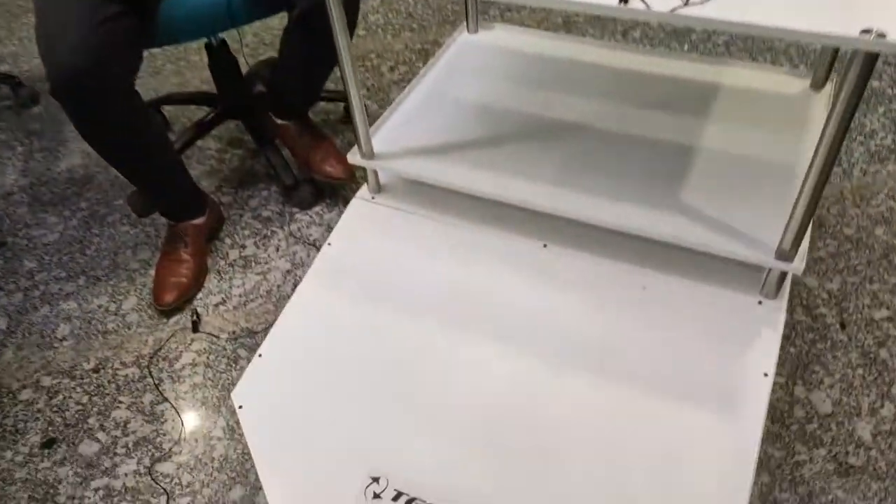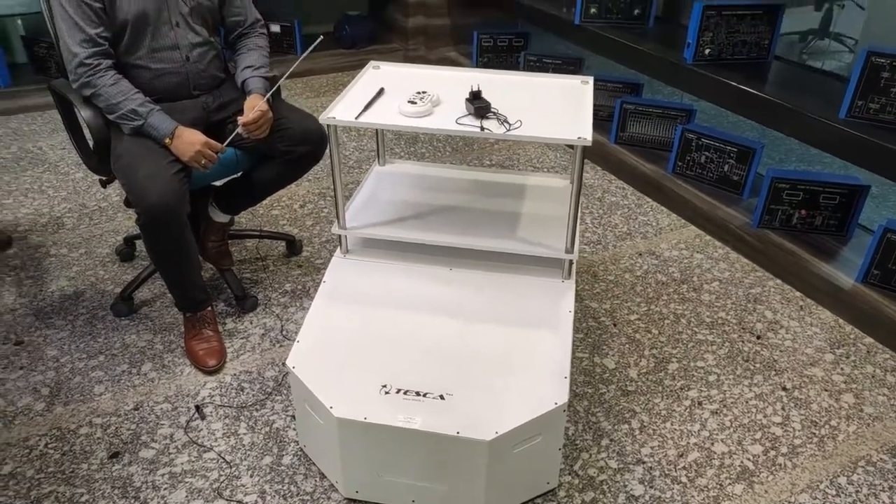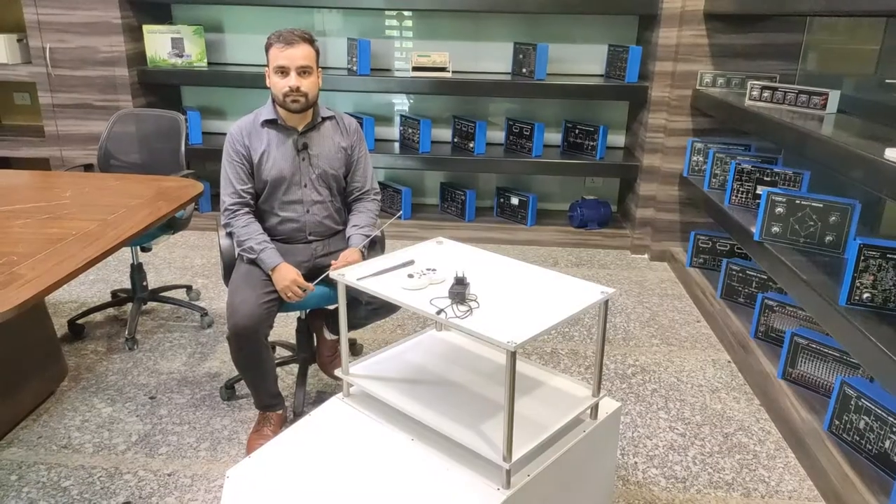Hello and welcome to Tesca Technologies Private Limited. In this video we are going to demonstrate our very new product, which is Sevak, also known as the patient serving cart. The order code for this cart is CS111. As we know, COVID-19 is spreading all over the world, so while treating COVID-19 patients, health workers are also facing threats from the virus. For the betterment of health workers, we decided to manufacture this new device called Sevak.